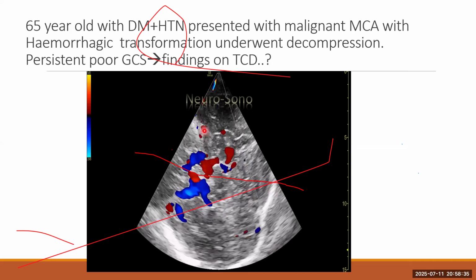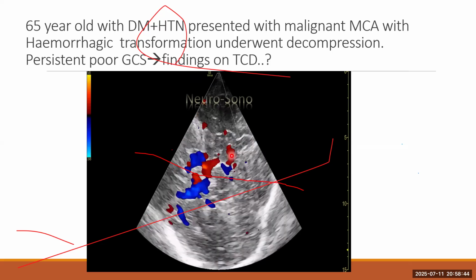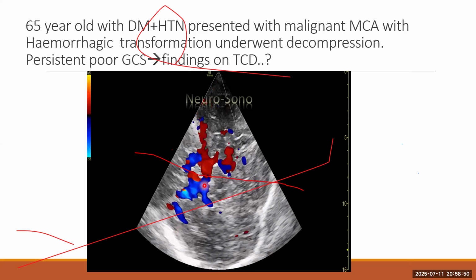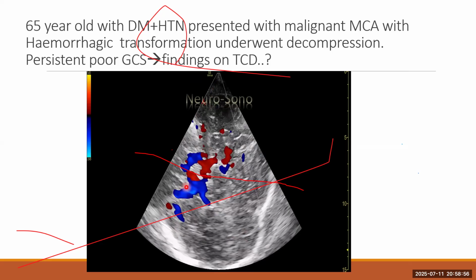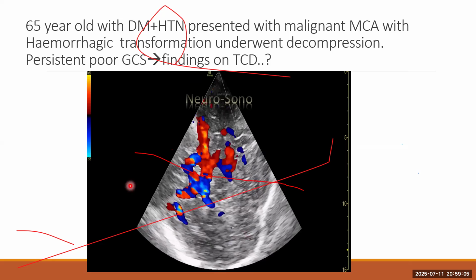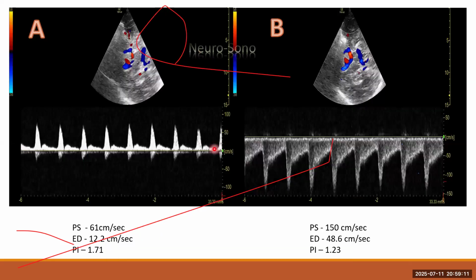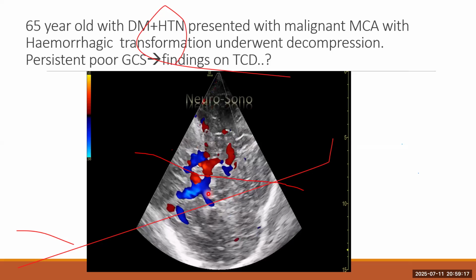Here we can see on the half towards the upper part of the screen, the video sort of comes and goes. Whereas on the lower part, even though it is sort of coming and going, there is no point where there is an absence of an image. So this could be a videographic representation of high pulsatility index. In a brain death or cerebral circulatory arrest scenario, this is what is called a lighthouse sign. It comes and goes. We can see this here, and it's more consistent here.